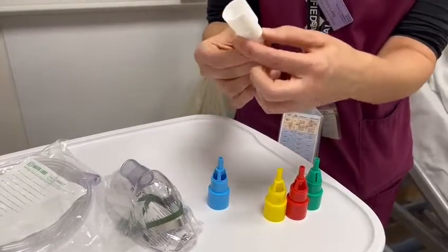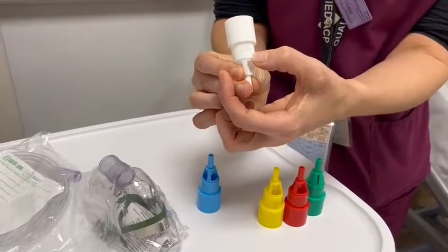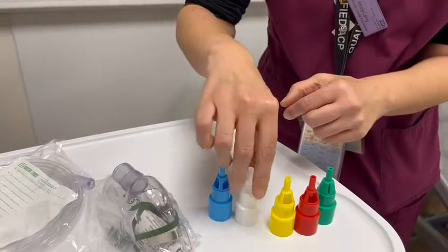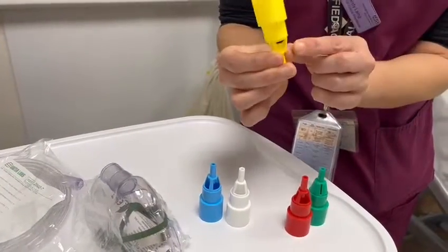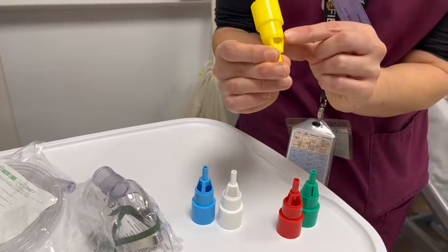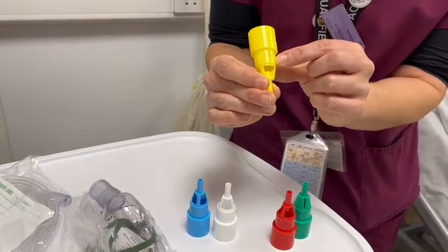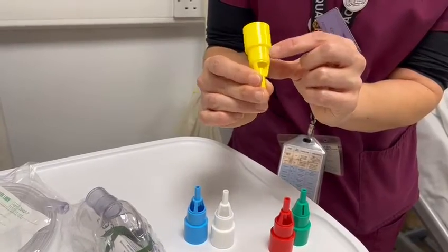You will have the white one, which is our 28%, and that delivers 4 litres through the oxygen. You'll have our 35%, which is the yellow one, and it details just below it how many litres — which is 8 — that is required in order to deliver 35%.